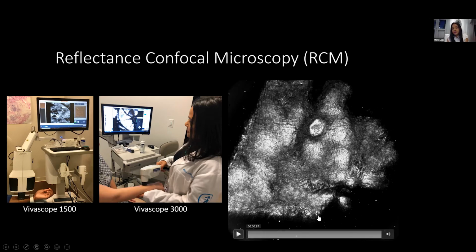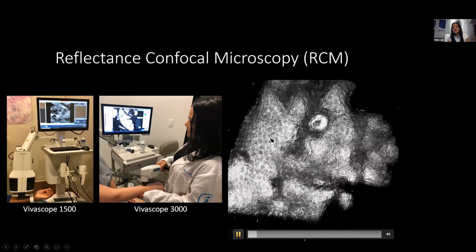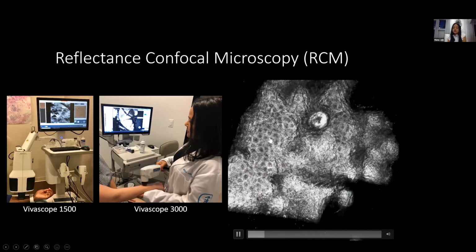How the skin looks is very interesting. Even patients want to see that. You see, we are at the dead layer of the skin right now. So it starts looking at the skin from top to bottom. The first layer of the skin is dead and it is very bright on confocal microscopy. When I play this video, you'll start seeing these dark holes appear. We are going into a nucleated layer, which we call stratum spinosum.